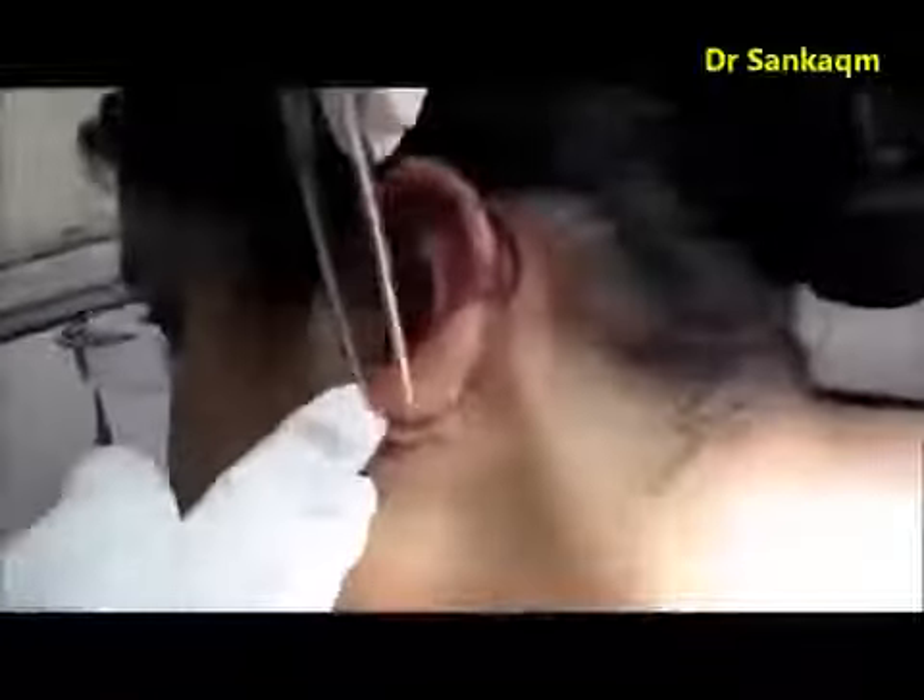I usually use 5-0 or 4-0 nylon for stitching in the face and ear lobe for a better cosmetic result. You can see I am just removing the stitches. While removing the stitches on the posterior surface, I am just turning the pinna anteriorly.